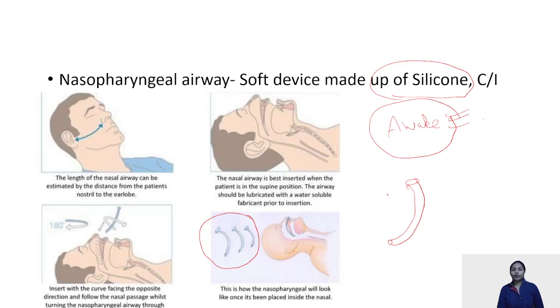When we talk about the nasopharyngeal airways, one question that is generally asked is the contraindications of the use of NPA. Always remember, as practitioners, as physicians, you always have to know when not to use a thing. Many a time we know the indications, but what is important is the contraindications, when you don't have to insert that thing into the nose. When? First, basilar skull fractures. In patients who have basilar skull fractures, kindly don't insert your nasopharyngeal airway because this is going to lead to CSF rhinorrhea and even your NPA can migrate into your brain.